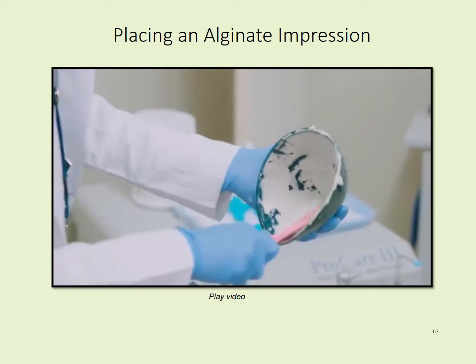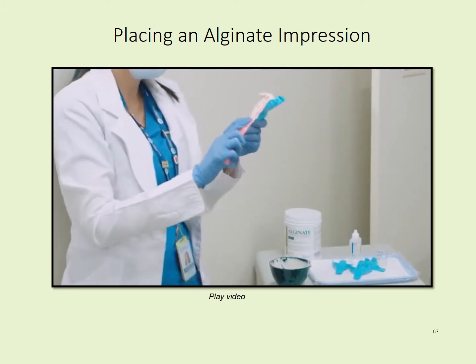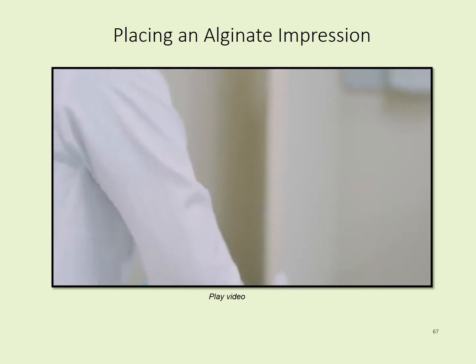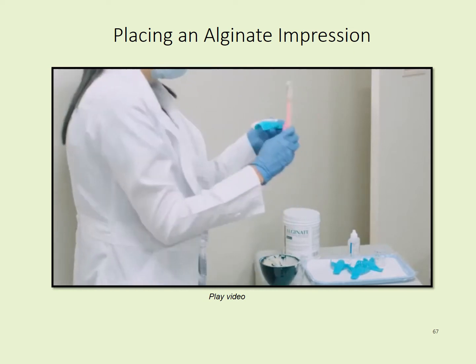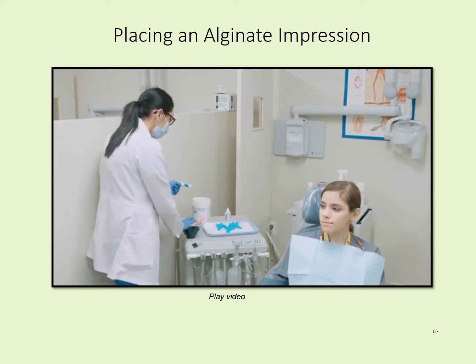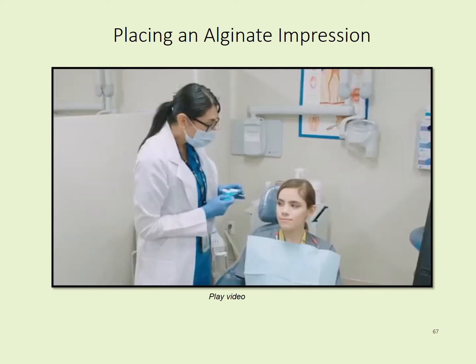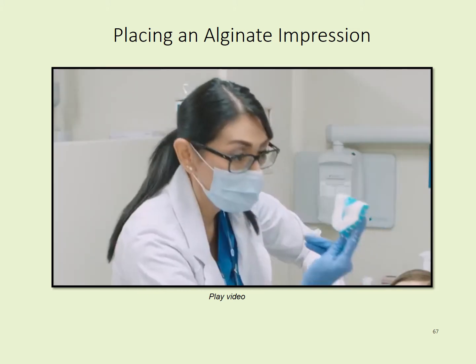Okay, we'll take 1 scoop, use the side of the tray, place it in. Again, you can use your finger or the spatula to help make sure that alginate impression material is smooth in the tray. Okay, go ahead and open. Retract with the finger, hold your tray like so.